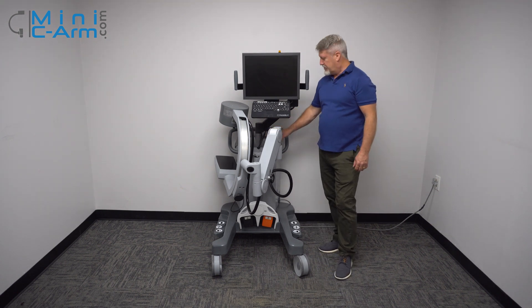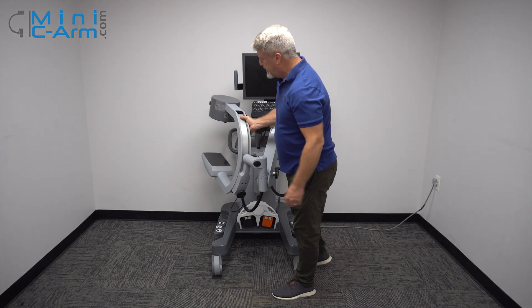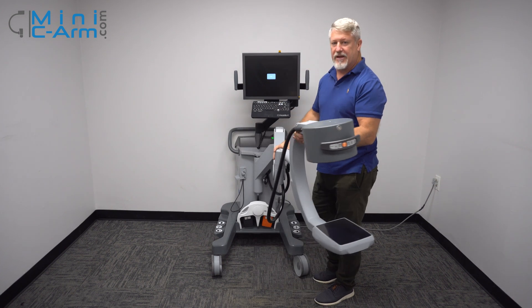To turn it on, just press the power button up here on top of the chassis while it boots up. It takes about a minute or so for it to boot up. We'll go over some articulation of the C-arm.